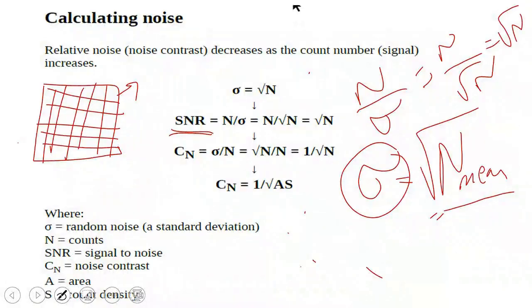The signal to noise ratio and something like the noise contrast. For example, in any paper you read, you will find that it says, I want to perform the quantitative measurements and the qualitative measurements. The qualitative measurements involve subjective analysis, such as the scoring that the doctor gives, saying whether this image is fair or what its quality is like. The quantitative analysis always works on these parameters, which are the signal-to-noise ratio, the contrast-to-noise ratio, and something called noise contrast.